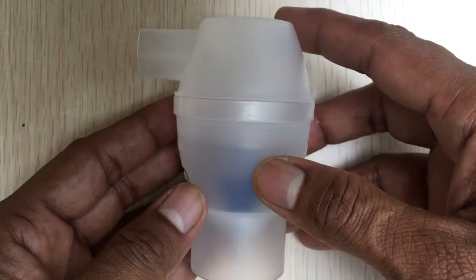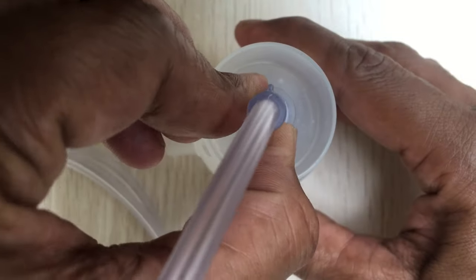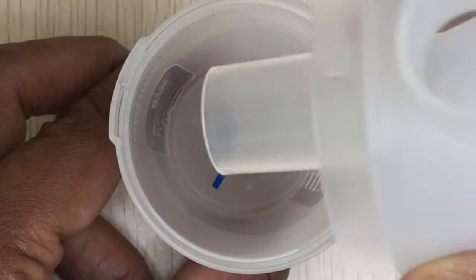To begin, pick the medication tank. Connect the air tube to the medication tank at the bottom and place it on the holder. Remove the inhalation top by gently rotating anti-clockwise and lifting.